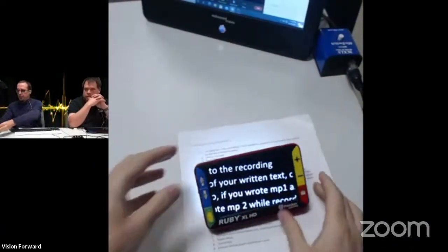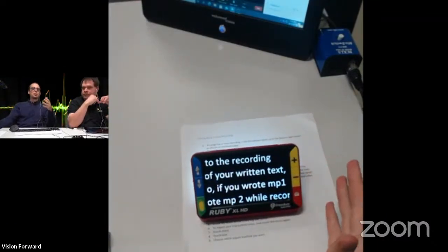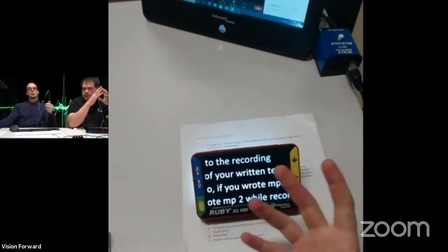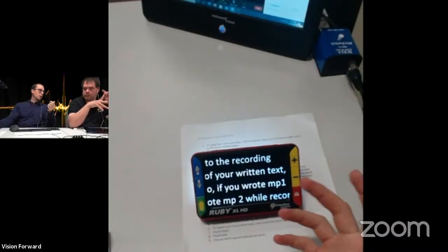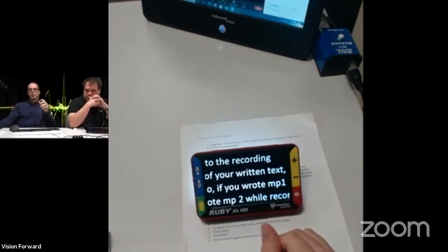So there's many different manufacturers and many different models of these, but the basic features tend to be the same, essentially. For the most part, it's just the size of the screen that you're going to be interested in, maybe whether it has a handle or not. Battery life tends to be about 2.5 to 3 hours. Some of them are able to read aloud to you as well. This particular one is not, but some of them are, some of the newer ones in particular.